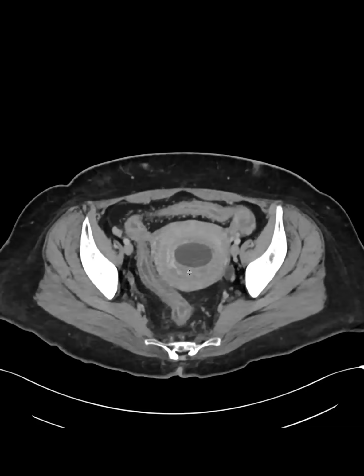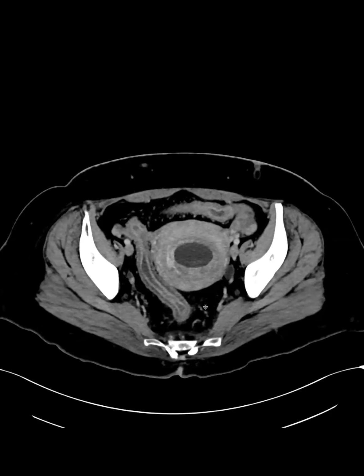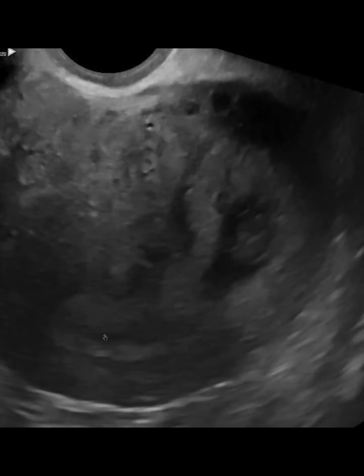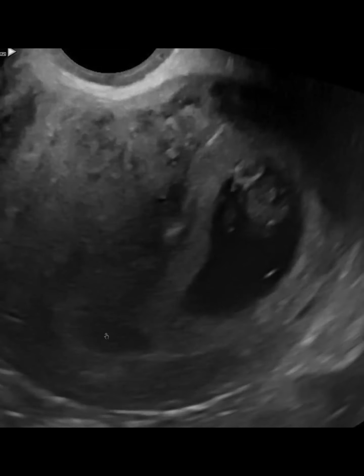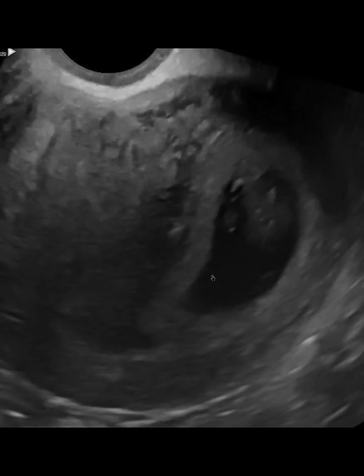I was wondering if you might see a tiny little fetal pole, like there was a little hyperdense thing right there, but I don't know, could be hallucinating. Yeah, right there. Needs an ultrasound. Yeah, and an ultrasound was done, and it confirmed it. Let's see if I can share the ultrasound. Nice. It's actually pretty far along. We see the yolk sac and the fetal pole. At that size, you probably can see a heart rate. Yeah, it was 8 weeks.